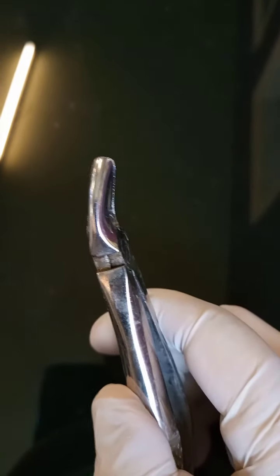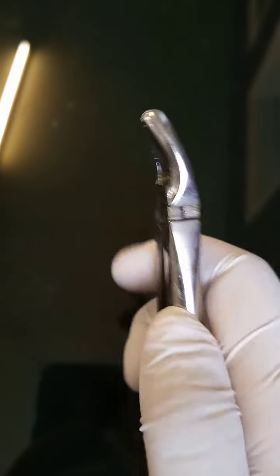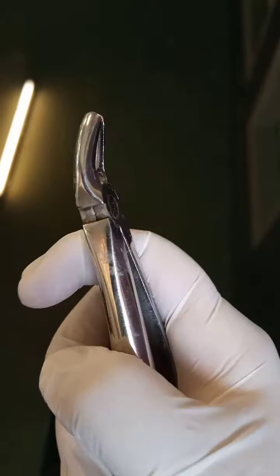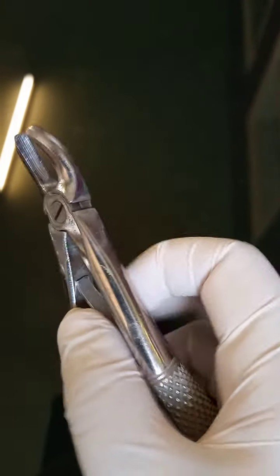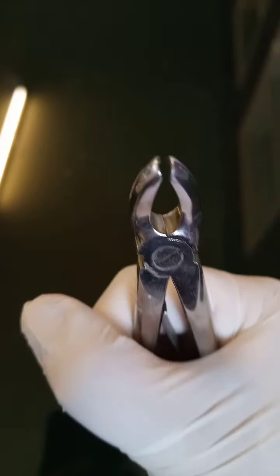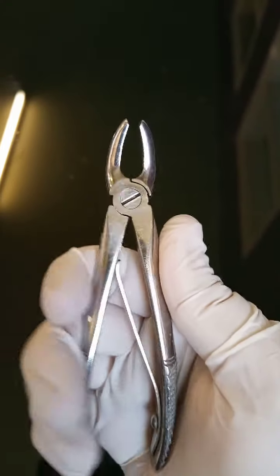The only difference between the anterior forceps and the forceps for premolar is that you can see that the beaks are slightly angulated to the handle. This is the only difference between the premolar forceps and the anterior forceps. You can see the space between the beaks.